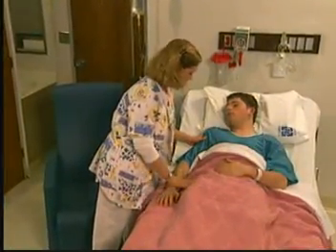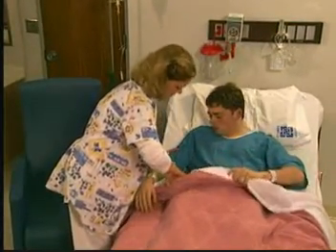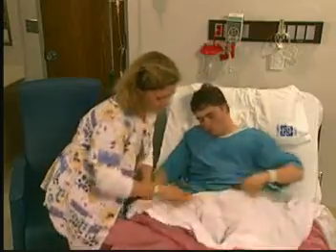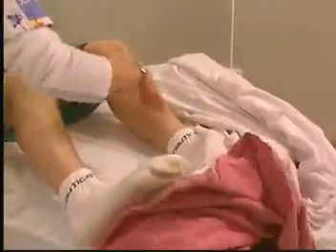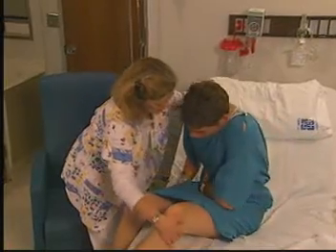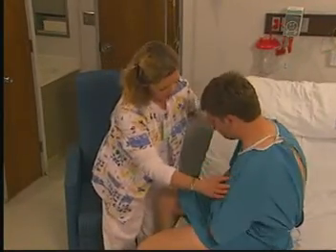Maintaining the integrity of an intravenous infusion is an important part of your patient's total care. Regular systematic assessments of your patient, the IV site, and the infusion are necessary to ensure safe and appropriate care. Think critically and anticipate how the patient should respond and what type of complications might develop.